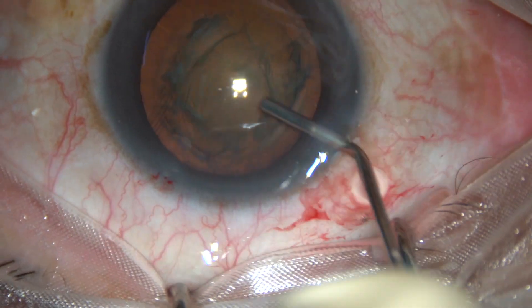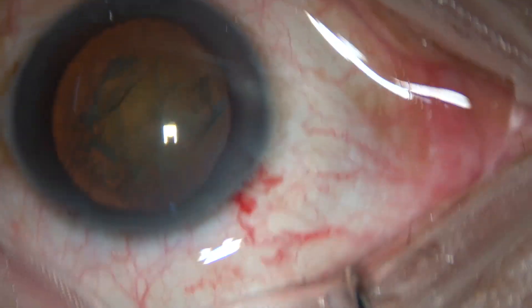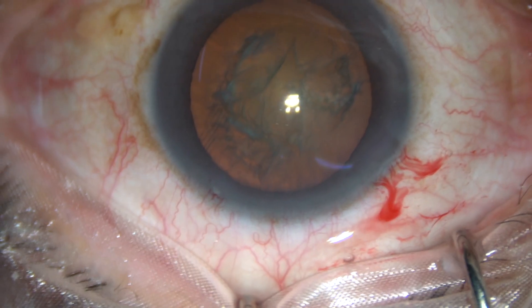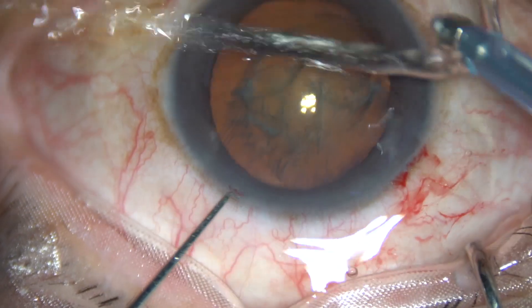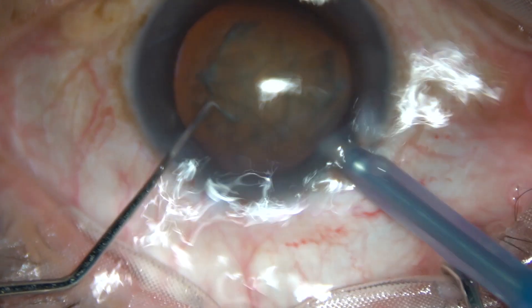Thus capsulocortical adhesions are broken, and now see a vertical chop. Vertical chop is: you hold the nucleus at the center, the chopper is just in front of the main incision and the phacotip, and you just divide the nucleus into two parts and two fragments.